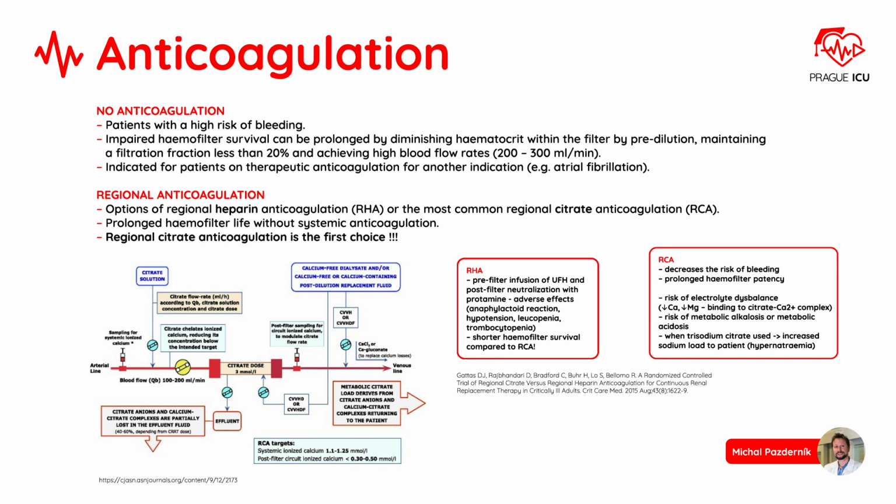Regional citrate anticoagulation decreases the risk of bleeding, and it also prolongs hemofilter patency. In contrast, there is a risk of electrolyte disbalance, risk of metabolic alkalosis or metabolic acidosis, and when trisodium citrate is used, there is increased sodium load to the patient.